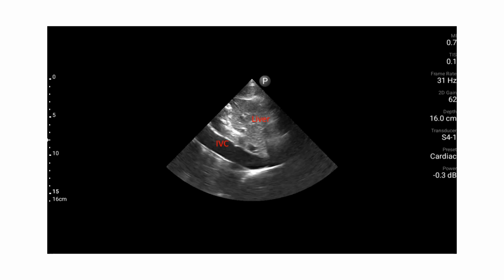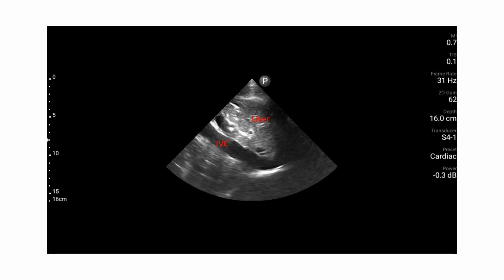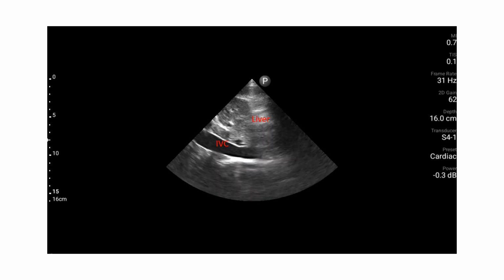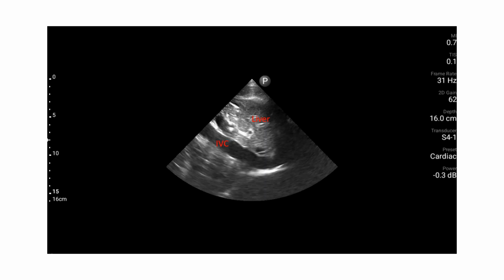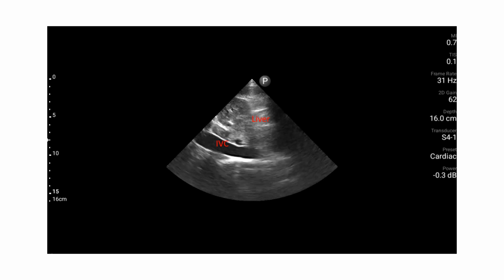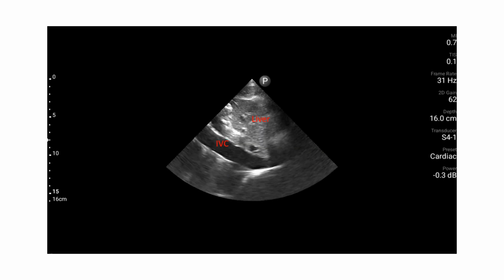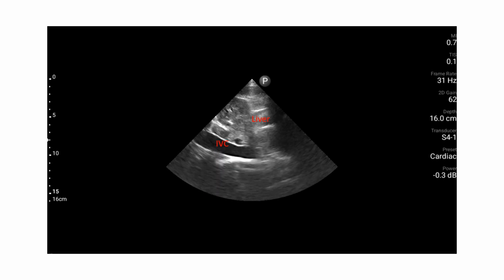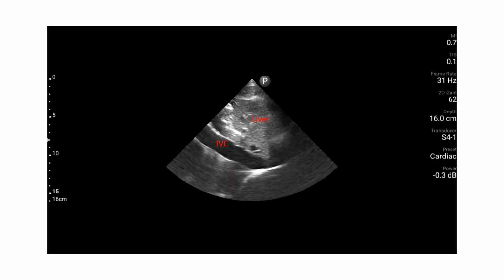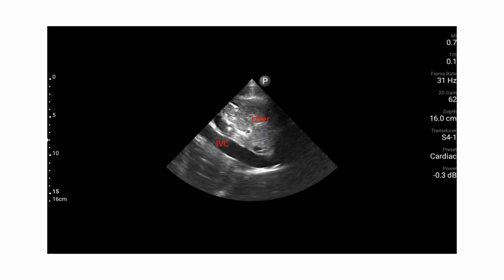And so if you have a collapsing IVC and a hyperdynamic heart, that is certainly a reasonable decision to give that patient fluids, compared to if you have a patient with poor cardiac wall motion, poor ejection fraction, poor systolic function, and non-collapsing IVC. That's more so to maybe tell you, let's skip the fluids, let's try an inotropic drug. Or maybe perhaps I see a dilated right ventricle that's compressing into the left ventricle, and a non-collapsing IVC. That might key me in that I have perhaps a pulmonary embolism.